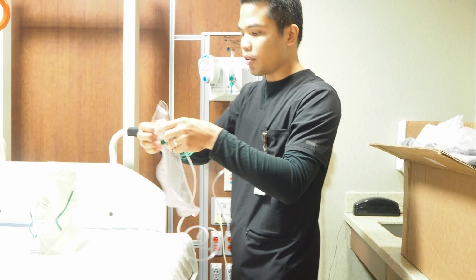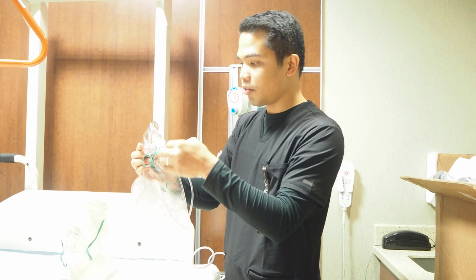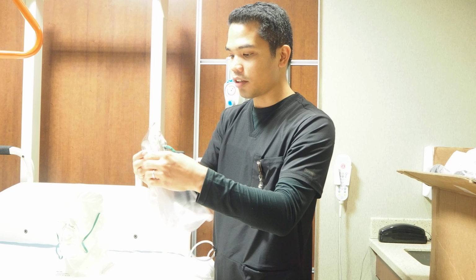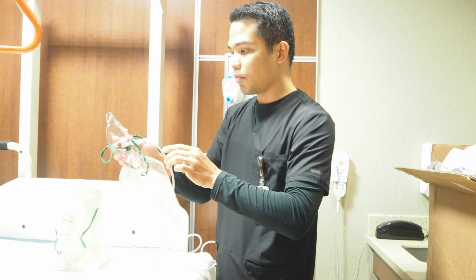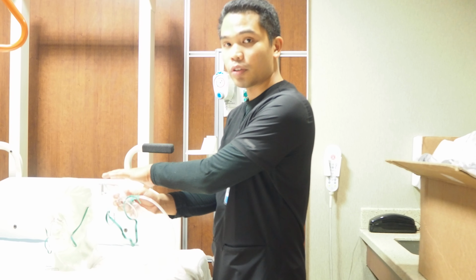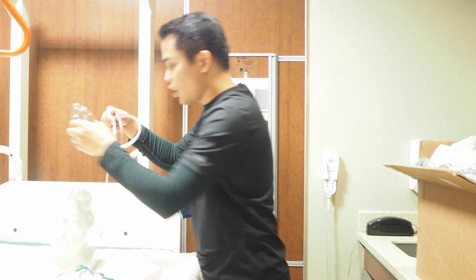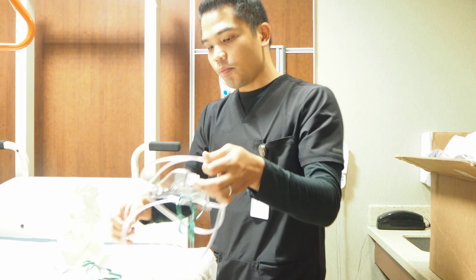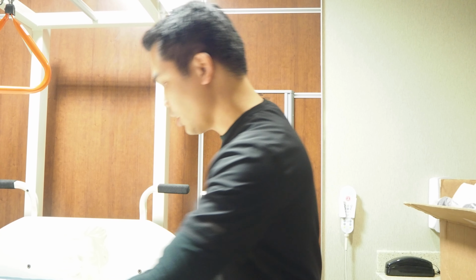And then once you set it up, make sure that the valves are present, not missing, and then observe the bag to be fully inflated. Make sure that it's inflated before you put it on the patient. And then with a simple mask, you can just put it in a clean plastic container, just in case the patient needs this in the long run.